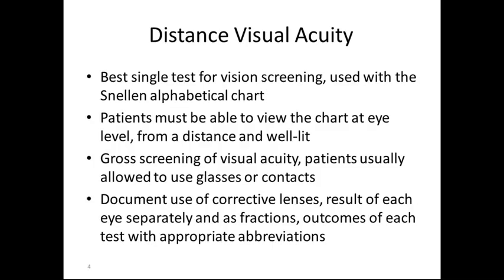Document the use of corrective lenses and the result for each eye separately and as fractions. Outcomes of the test are recorded with appropriate abbreviations, and we will discuss this in a little bit.